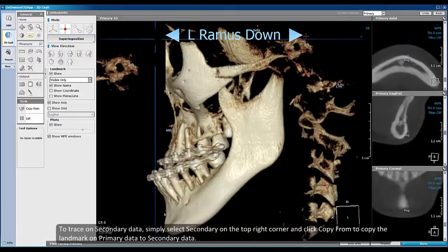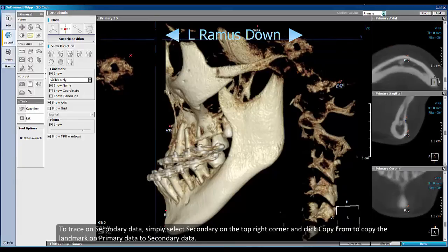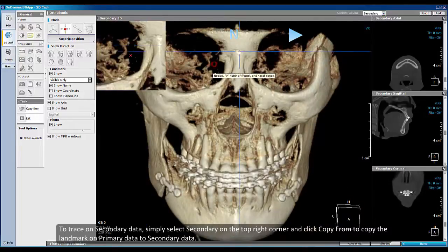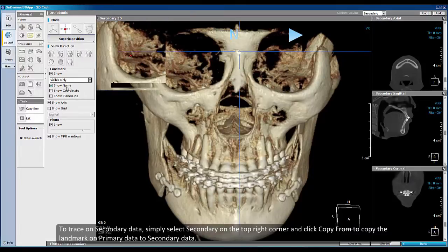To trace on secondary data, simply select Secondary on the top right corner. Now click Copy From to copy the landmarks on primary data to secondary data.